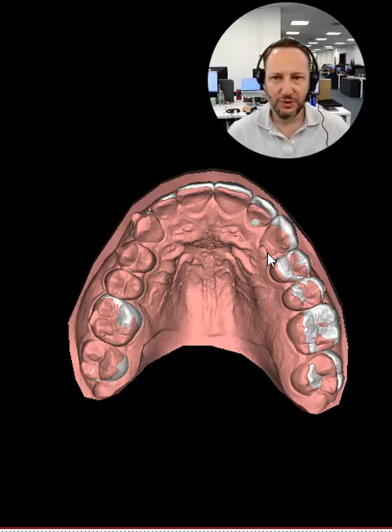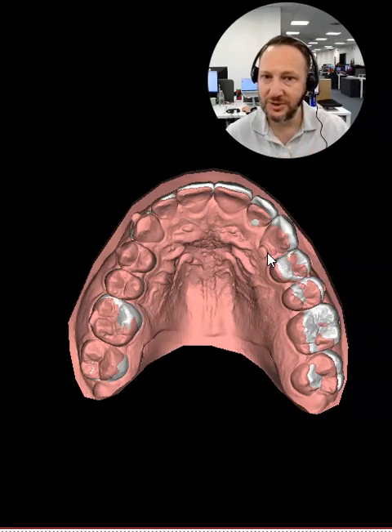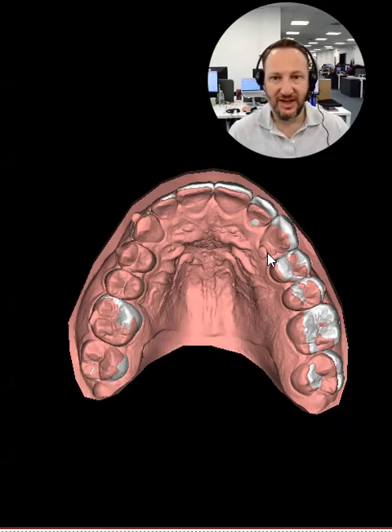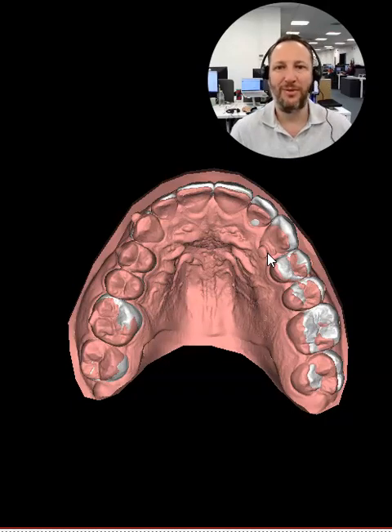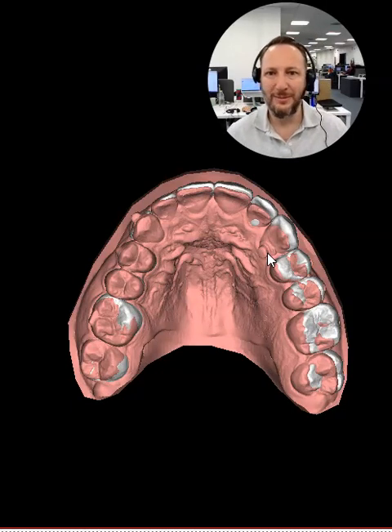So summarizing here, the four advantages of using DSD with Invisalign or with aligners are: one, to test drive a lot of options and validate these in the computer, make mistakes in the computer to avoid making them in the patient's mouth. The number two, to bring the patient on board so they can participate, visualize, understand better, and make better decisions, accepting the ortho more.